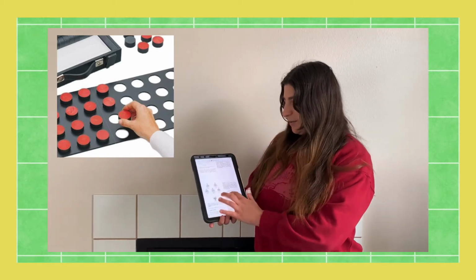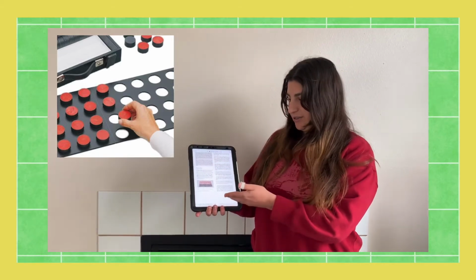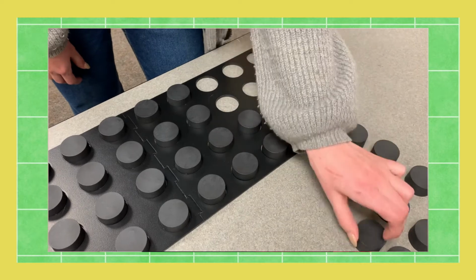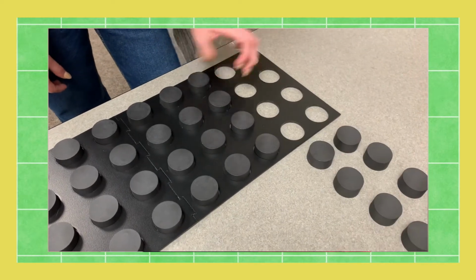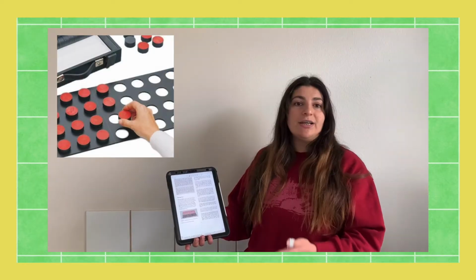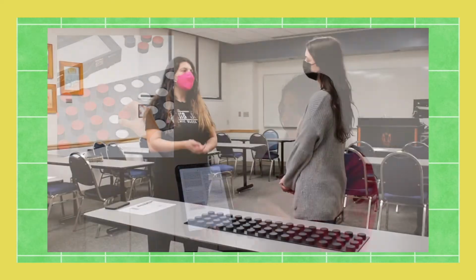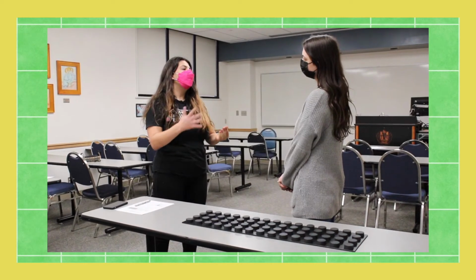The first subtest of the Minnesota Dexterity Test is going to be the placing test. So what you're going to have the patient do is you're going to set up the board according to this image here in the manual. For each of the 2 subtests that you will be administering, you will read the script that's provided for you in the manual here.